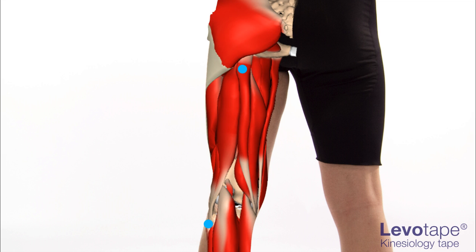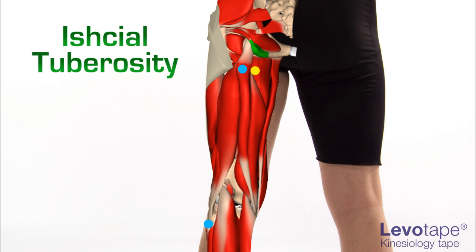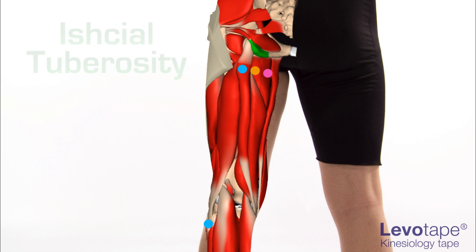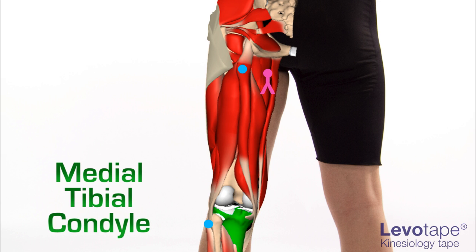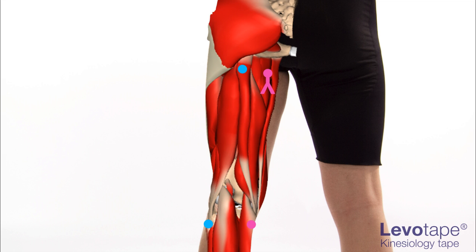The base point of the Y strip is located by measuring 2 finger breadths below the ischial tuberosity, and from that point measuring 2 centimeters medially. The tape then splits into a Y and extends distally to the medial tibial condyle. The end of each Y tail converges at a corresponding level with the end point of the I strip.